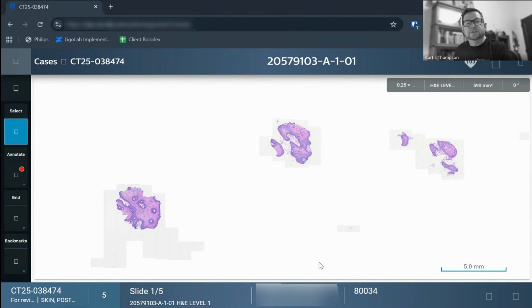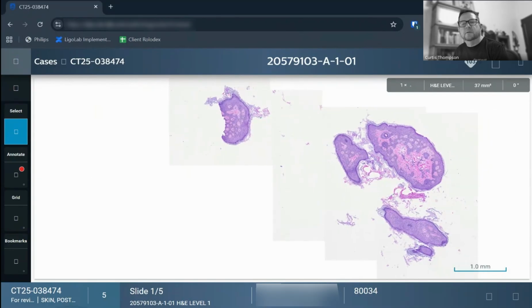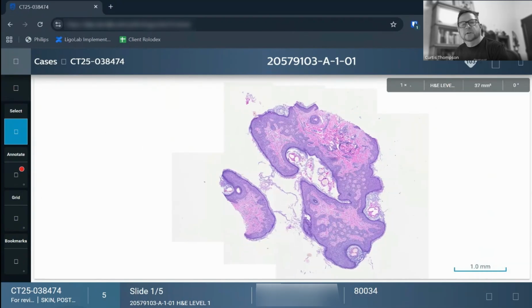So the clinical suspicion is that he has what's called male pattern hair loss or androgenetic alopecia. And this also occurs in women with diffuse hair loss. So we take the biopsy and we start at the skin surface. And this area right here is absolutely at the top, the skin surface, and it's cut transversely. So we're looking across it.